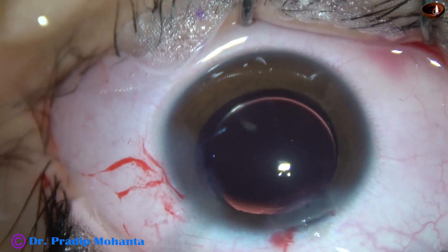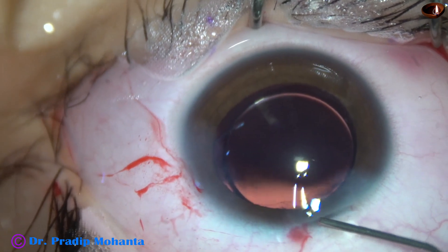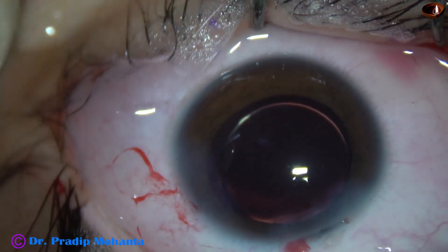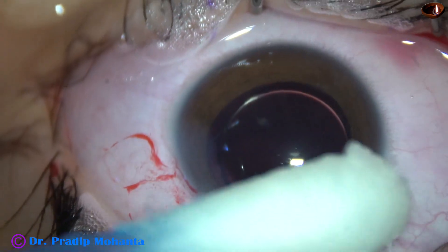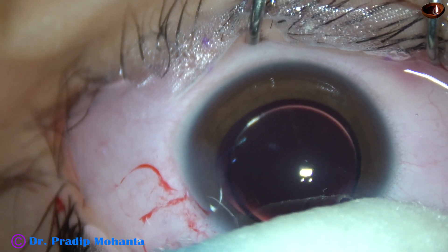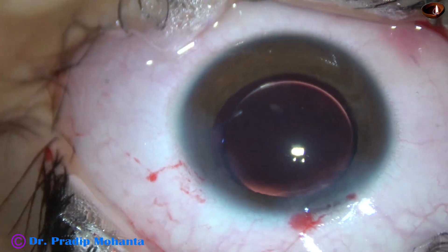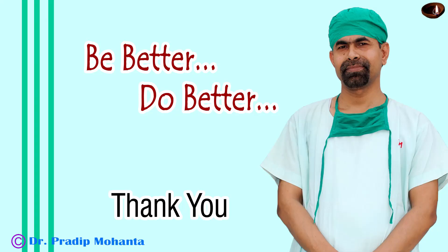The patient was convinced that clear lens extraction with intraocular lens implantation was a better option for her, considering the financial strength of the family. After cleaning the viscoelastic, the surgery is done. I check the integrity of the wounds — there should not be any leakage, and there is none. Thank you very much for your attention. I hope this video will inspire you to perform clear lens extraction and intraocular lens implantation for patients who cannot afford a phakic IOL and who cannot undergo LASIK surgery.